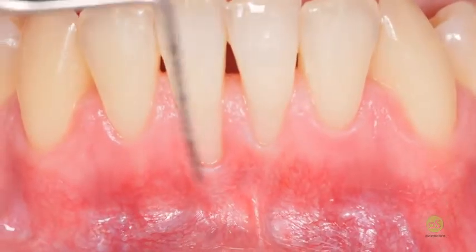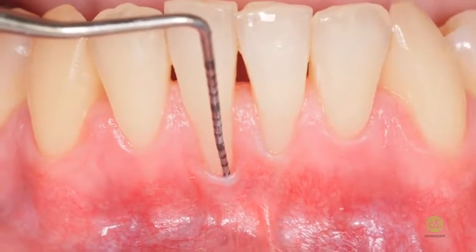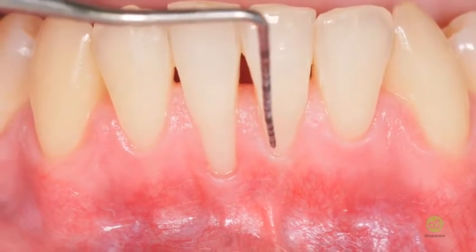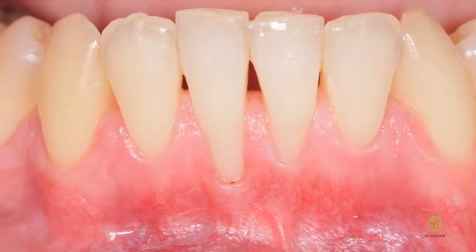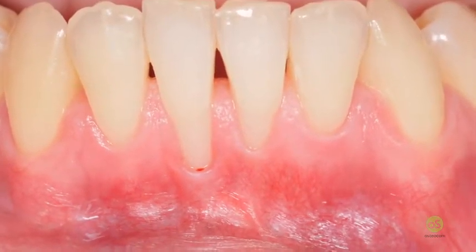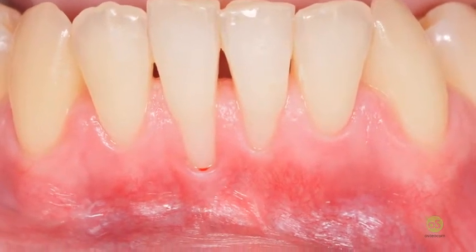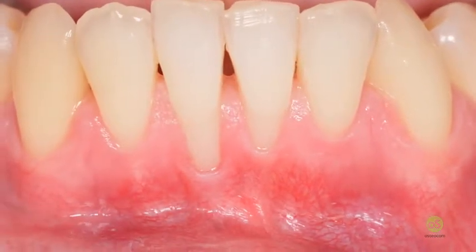As you can see, there is almost no remaining keratinized tissue. This is not keratinized tissue, you see it's alveolar mucosa, and the amount of keratinized tissue remaining at the level of these teeth is almost nothing. So in this situation, it's absolutely mandatory to use a connective tissue graft. There is no way of using the matrix, because we need to improve the stability of our flap at the time of the surgery.